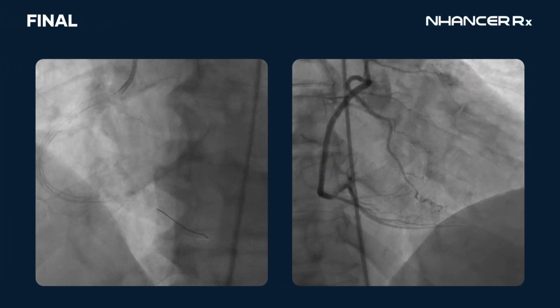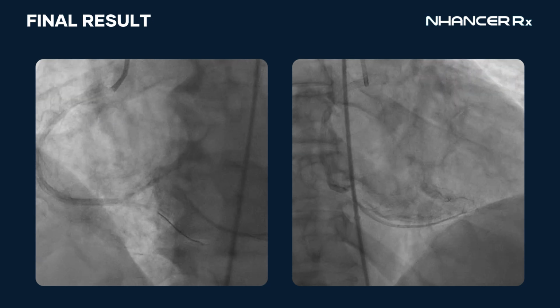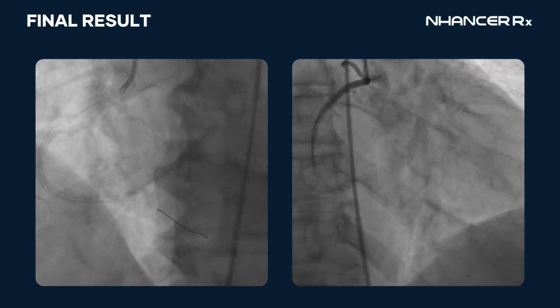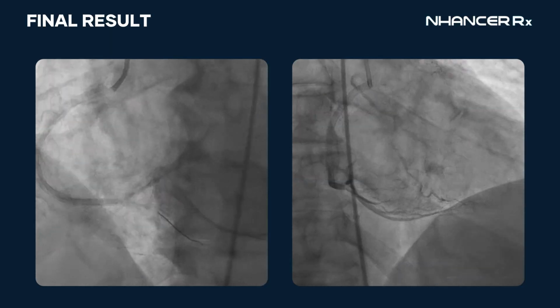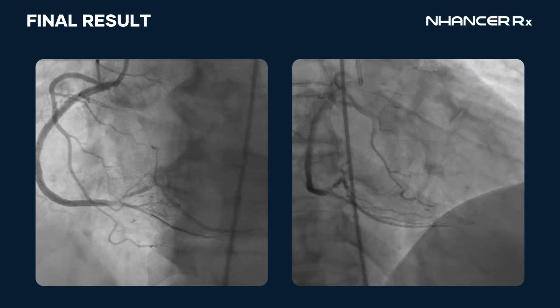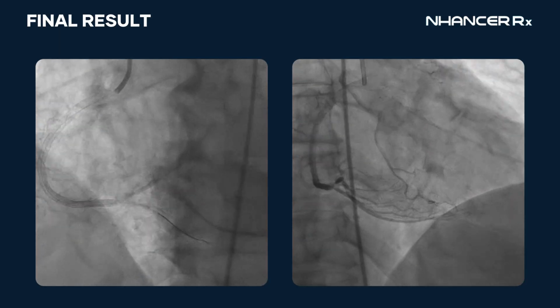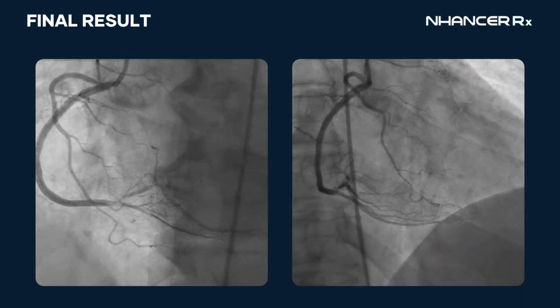And then after 3 overlapping stents were placed, you can still see some dissection in the distal vessel, but we have good TIMI 3 flow now in both the RPL and RPDA branches, and we've covered the flap, and so in order to avoid bifurcation stenting and even more stents, I elected to accept this result and treat the patient as he feels based on symptoms.